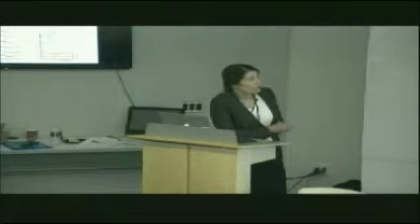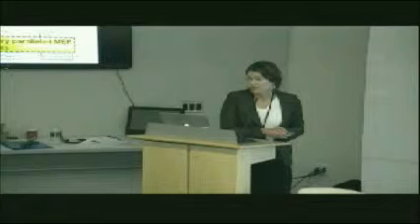So the overriding message is that these signals now get bigger as you go further from the time of damage. So this is great because the MEPs are now becoming more active, which suggests the muscles are more active. And it turns out that in this child, over 12 weeks, their walking improved substantially. This is important because the motor recovery paralleled the MEP improvements. So maybe TMS can offer a way to monitor not just the function, but what's changing really in the brain and spinal cord.